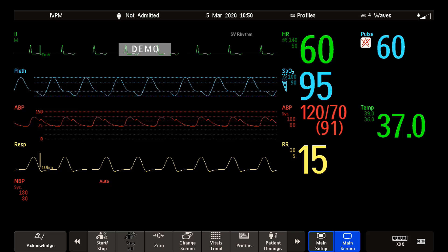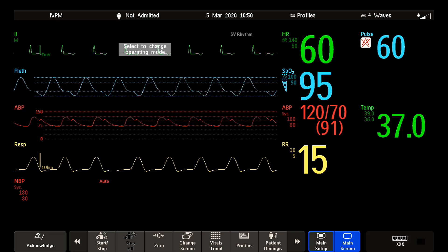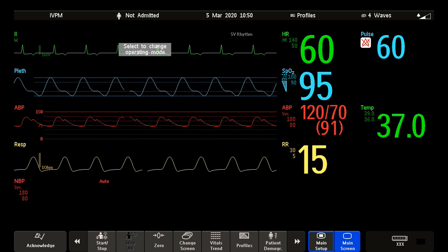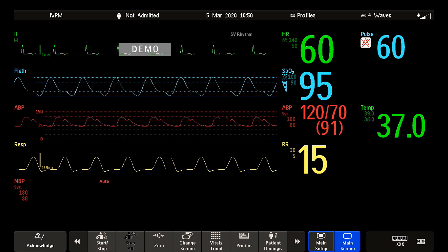Profiles are predefined monitor configurations. They let you change the configuration of the whole monitor so you can adapt it to different monitoring situations.